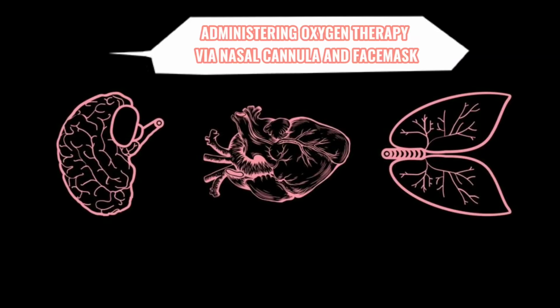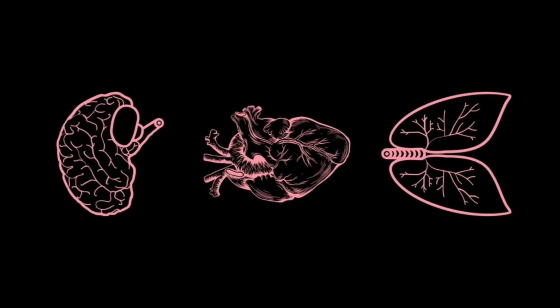Administering oxygen therapy via nasal cannula and face mask. Good afternoon. I'm Jamie Bervano and I will be presenting the assessment of administering the oxygen therapy.